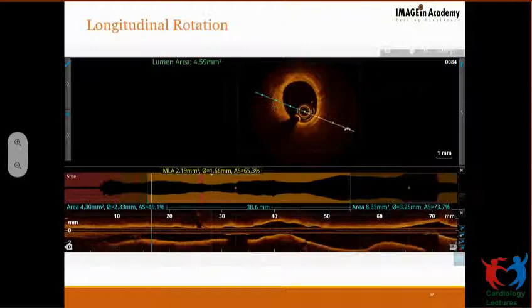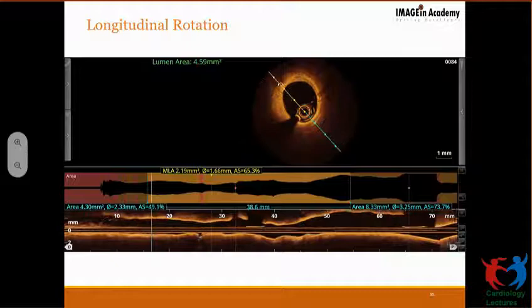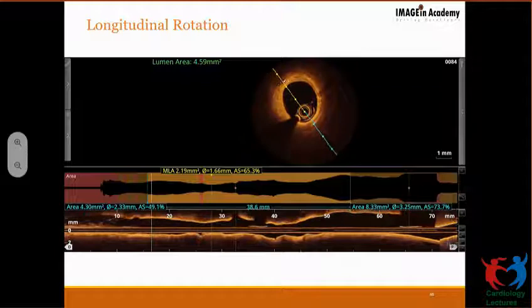Now you can rotate this toolbar, and as you rotate, you'll be able to see a change in the longitudinal profile. At times you feel that this vessel is broken and it's not complete. The moment you rotate, you will not only see the vessel complete, but you will also see different branches coming out. Generally, the diagonals and septals will be in the opposite direction. And it's very important to select a view where you'll be able to see the branches originating.